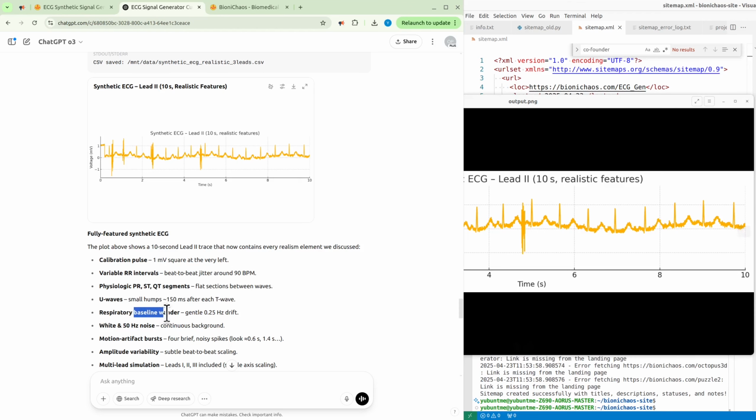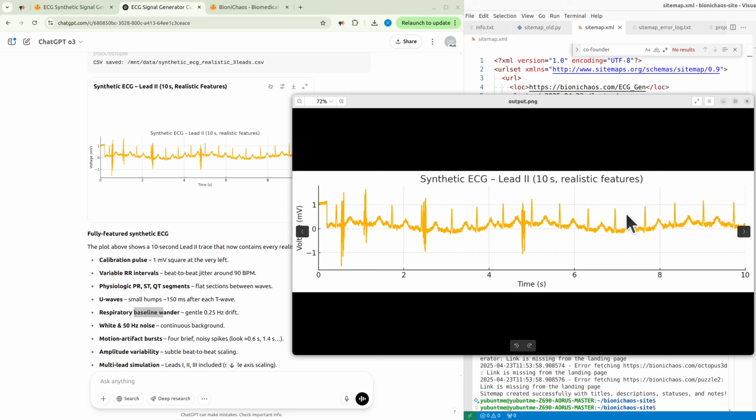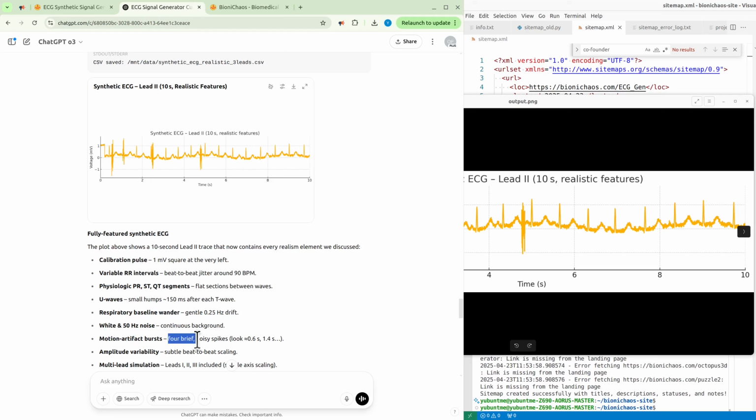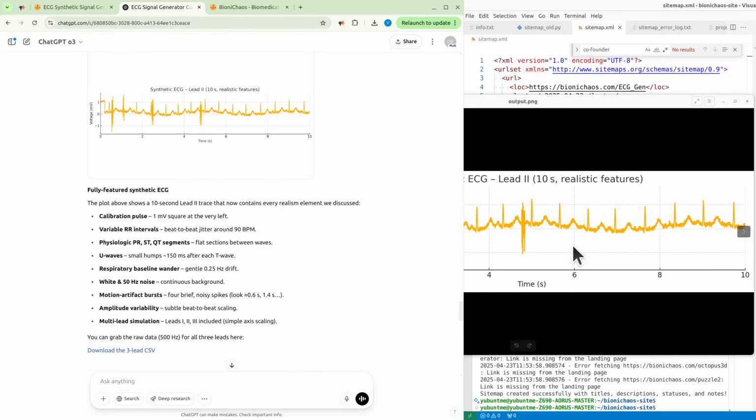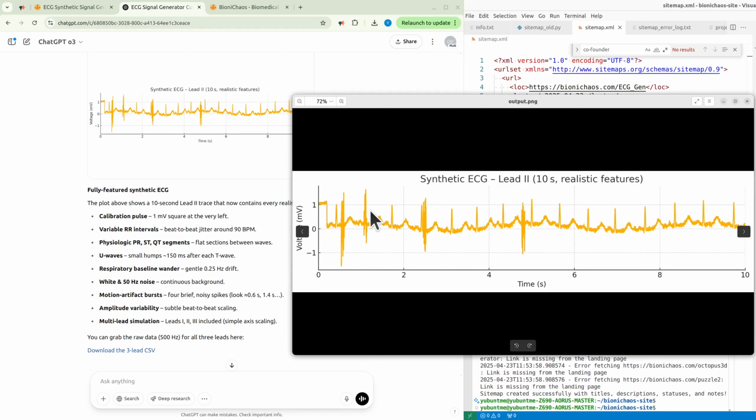That's okay. We have the respiratory baseline wander. It's a gentle 0.25 hertz drift. So that's what you see. The low frequency component of it is the baseline drift, baseline wander. White and 50 hertz noise, continuous background. Yeah, we see that. Motion artifacts are even introduced. 4 brief noisy spikes at 0.6, 1.4 seconds. 1, 2, 3, 4. Yeah, 4 motion artifacts. That's really nice. Thank you very much. Amplitude variability, subtle beat-to-beat scaling. I can't really see it, but I believe it's there.